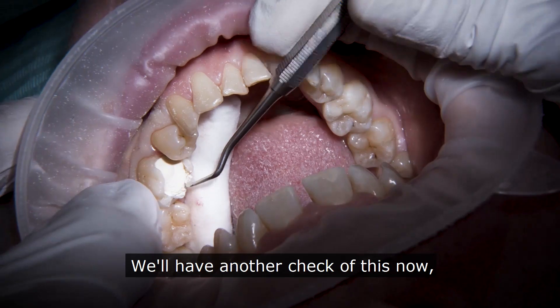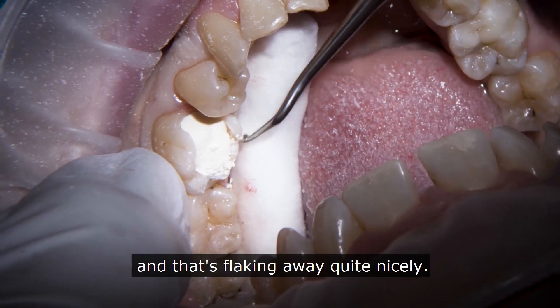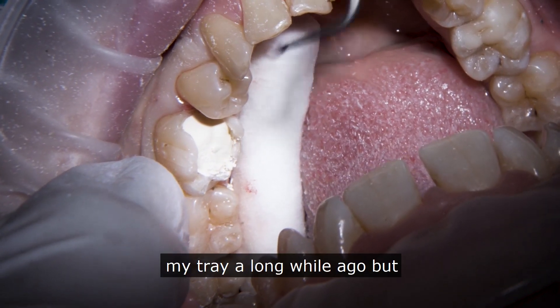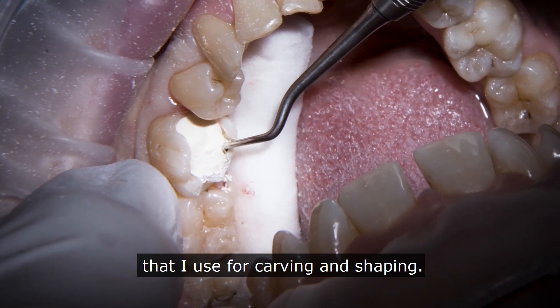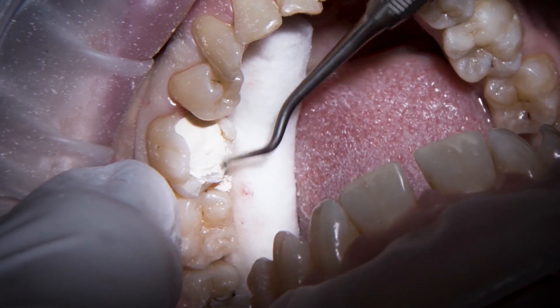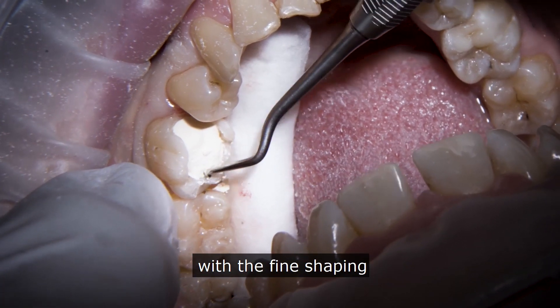We'll have another check of this now just to see if we're pretty much ready to go. It's getting a little bit chalkier and flaking away quite nicely. I stopped using an excavator on my tray a long while ago, but since I've been back using biodentine I've brought one back. The tools I use for carving and shaping — I try to get as much shaping done when I'm placing it, and then just do the fine shaping afterwards.